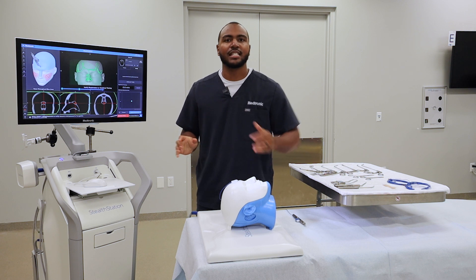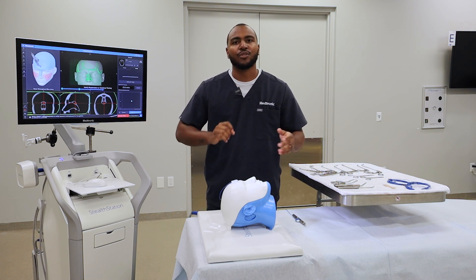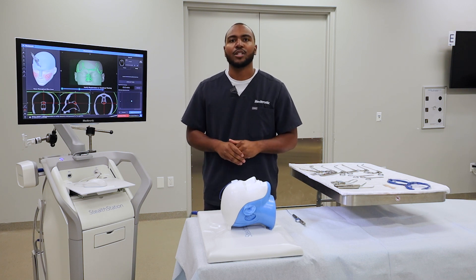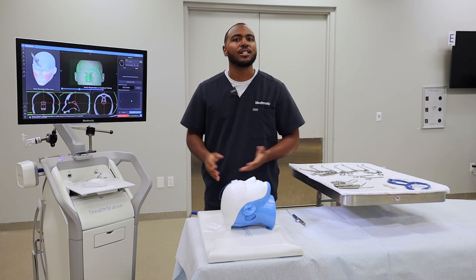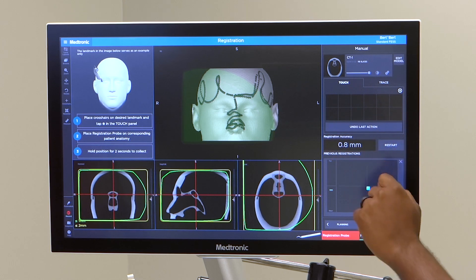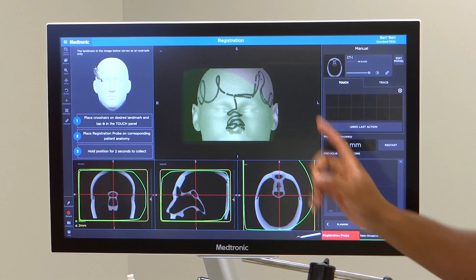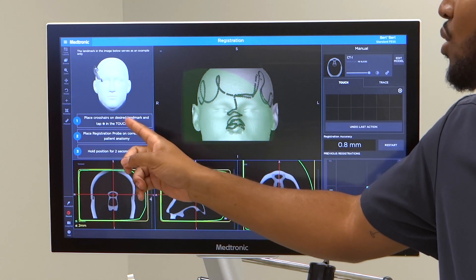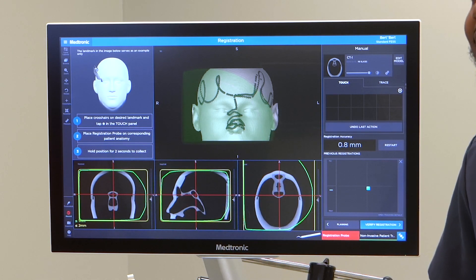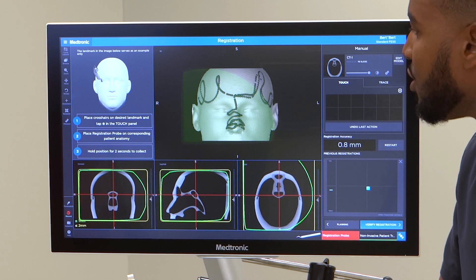If you've advanced to verify registration, checked the anatomy, and realized your registration accuracy isn't to your liking, you can add additional touch points. To do that, we were just in Trace — you'll want to hit Touch, and it prompts you with the next steps. The first step: place crosshairs on the desired landmark and tap the plus sign on the touch panel. This is a lot easier to do with the mouse, but you can also touch it on the screen. I'm going to use the mouse for this.